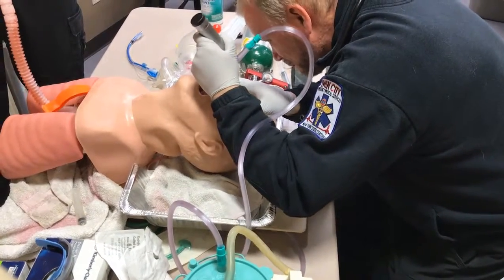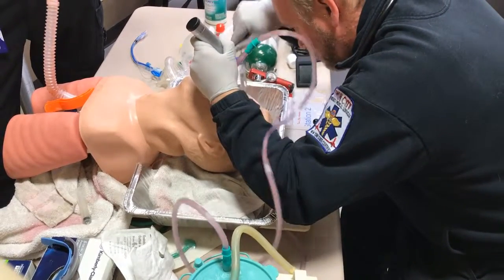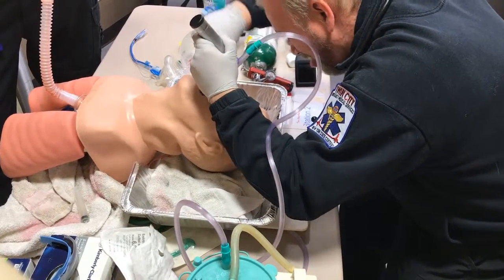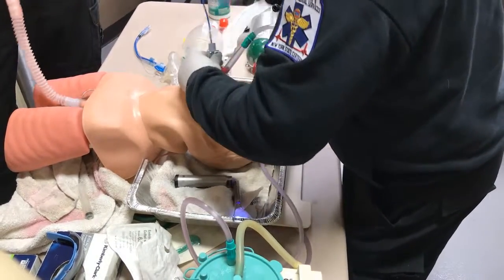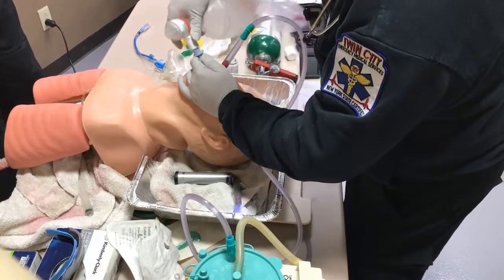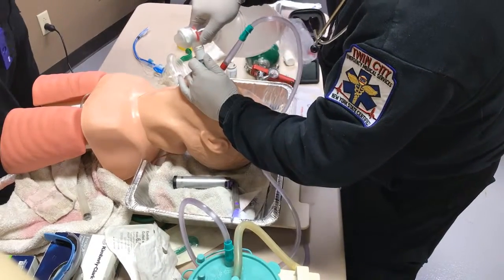Eventually, that stiff catheter goes right into the esophagus once you're able to visualize it, and then any further emesis that comes up is immediately caught before it has the opportunity to get in front of you. There are three things going on at once, and your placement of the rigid suction catheter into the esophagus just keeps that copious amount of emesis at bay. We see that Dominic was successful in visualizing and getting a tube in this situation.